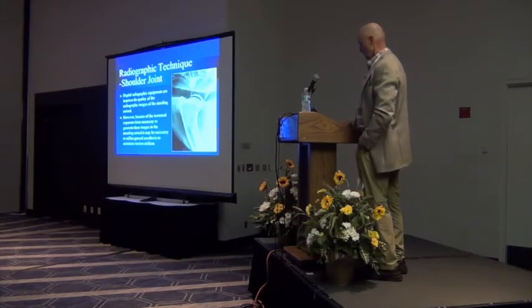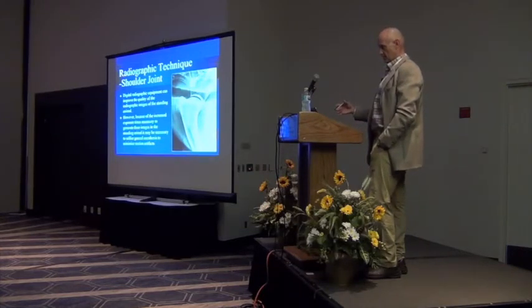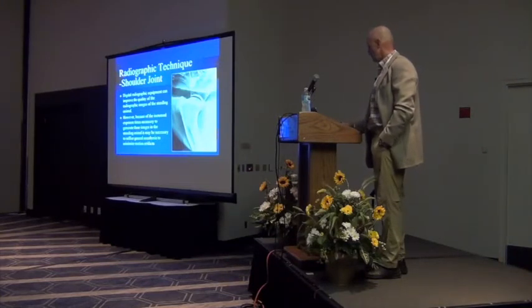Now, it used to be when we were trying to evaluate OCDs, we would drop them down and stick contrast in the joint. Well, we just go ahead and take the surgery now. If we're that uncomfortable, the horse blocks to the shoulder joint, and we can't see anything on the radiograph, I'm going to anesthetize him. I'm going to stick a scope in there and be done with it.